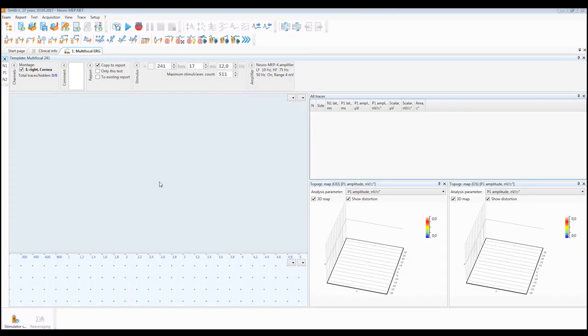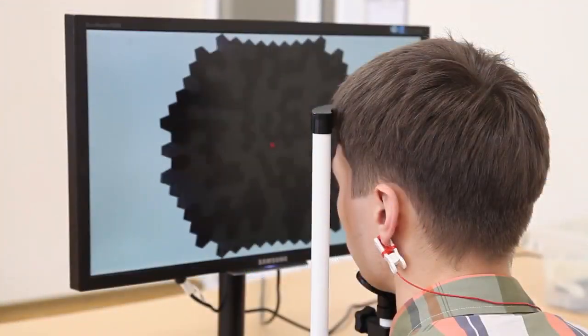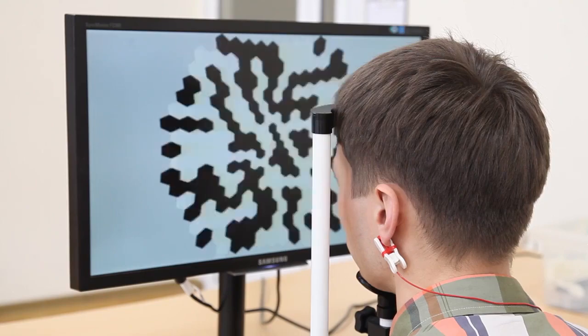Ask the patient not to blink during the stimulation and relax neck, shoulders and face muscles. Let's check the impedance. It's quite good, as we can see, and now we can start the stimulation. Please don't blink and look at the fixation point. While the stimulation continues, we can discuss the obtained responses.